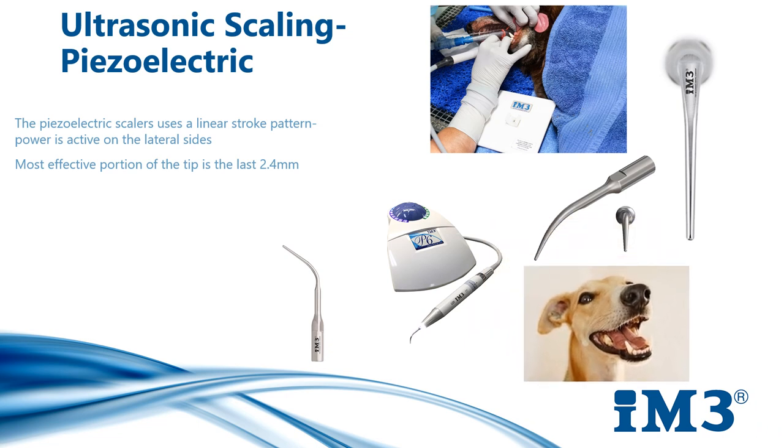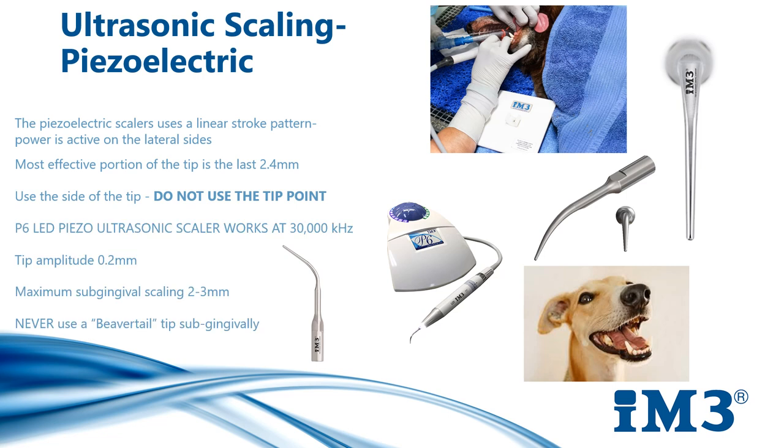Ideally the scaler needs to be fitted to the compressor and water supply of your dental unit, providing a nice even supply of water to the scaler tip. You can use a pump-up water supply, but this must be used carefully as uneven pressure can lead to excessive heating of the handpiece. Ultrasonic scalers have interchangeable tips. A perio tip can be used to scale to a maximum of 2 to 3 mm subgingivally, but never use the beaver tail tip under the gum line as this will cut off the water supply to the scaling tip and cause thermal damage to the gingiva.